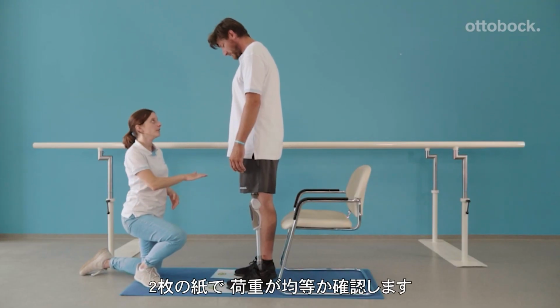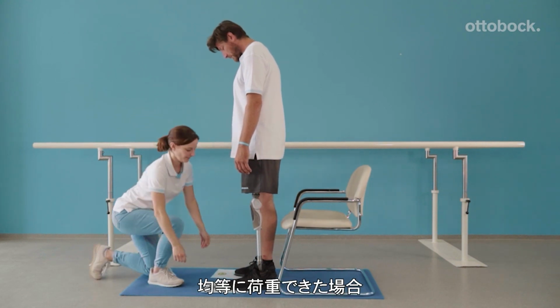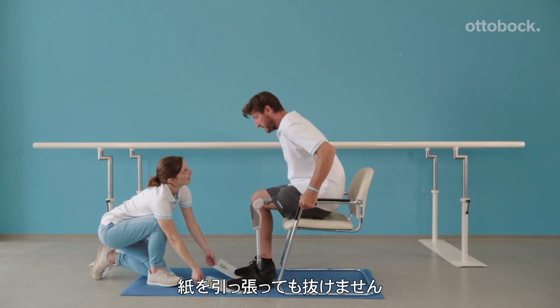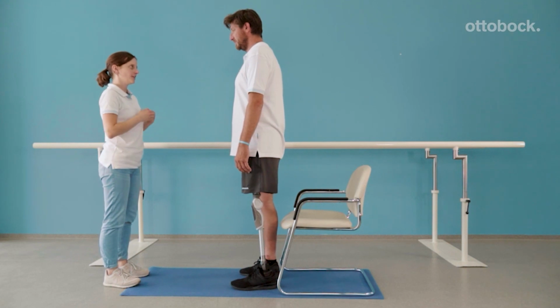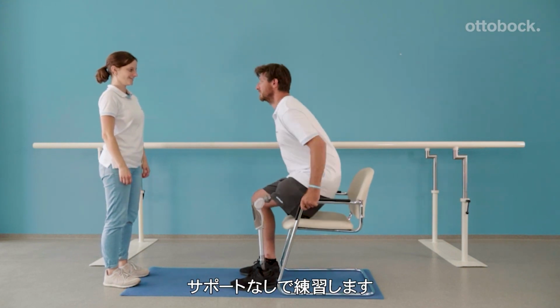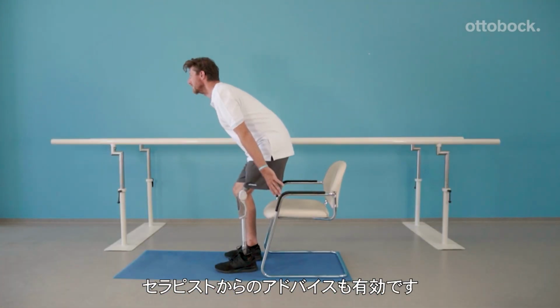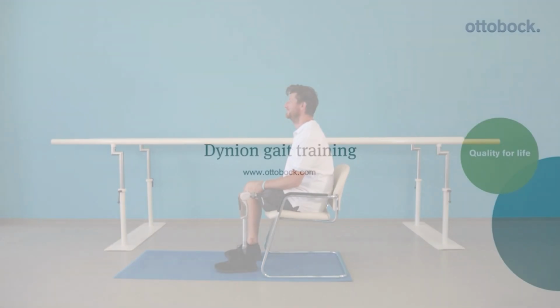Use 2 cards to test if weight is evenly distributed on both legs. When the weight is evenly distributed, the therapist cannot pull the piece of paper away while our model is sitting down. When our model is confident enough, he should practice sitting without assist, and the therapist can correct as necessary. An adjustment of stance flexion resistance might be necessary by the CPO.